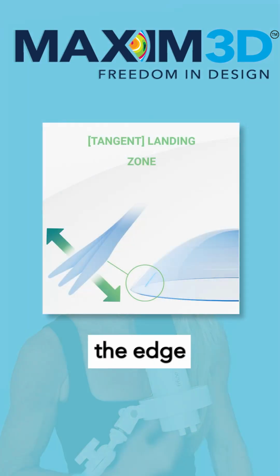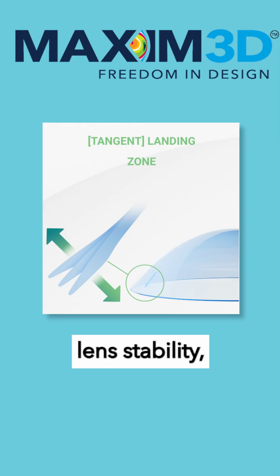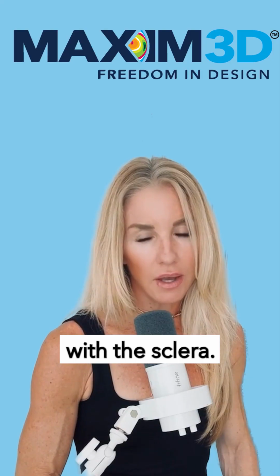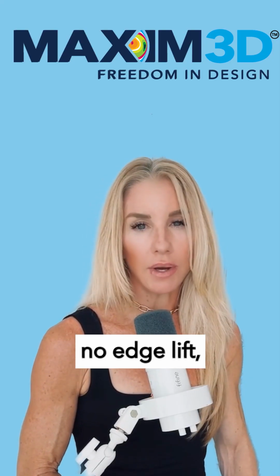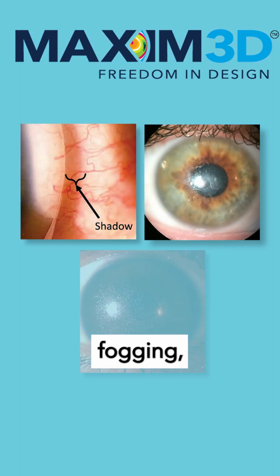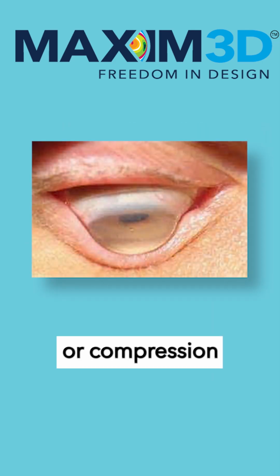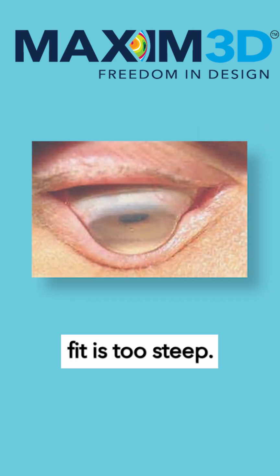Next, let's evaluate the edge or landing zone. This final zone controls lens stability, comfort, and tear exchange. An ideal fit is gentle, even contact with the sclera. No impingement, no edge lift, no blanching. Interpretation: if you see edge lift, fogging, or debris, this means the lens is too flat. If seal-off or compression is present, the lens fit is too steep.